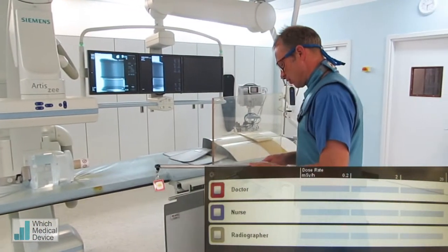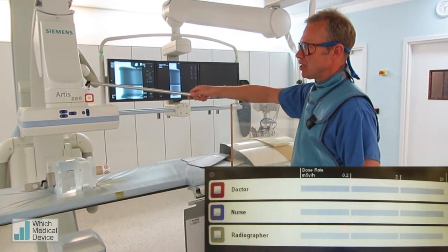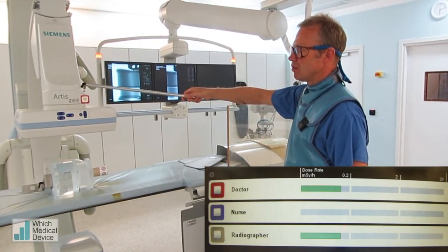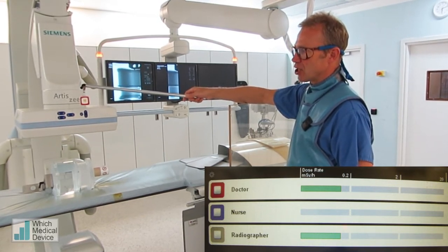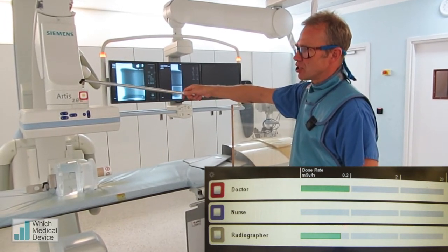We've got this fluoro system set at 7.5 pulses per second, and we're just going to start with the badge up here at about head and neck height, and we're going to screen. You can see that the dose will vary depending on position — in a green band, then it'll go orange, and then it'll go red when your dose gets very high. So up here at the moment, at 7.5 frames a second, the dose is not too bad.